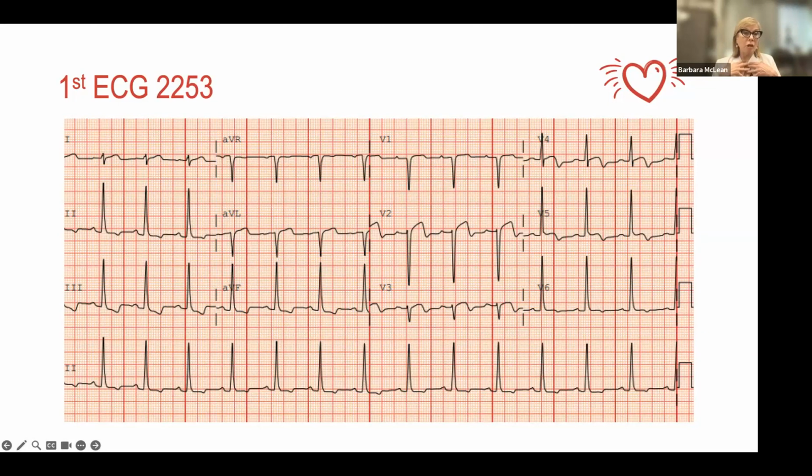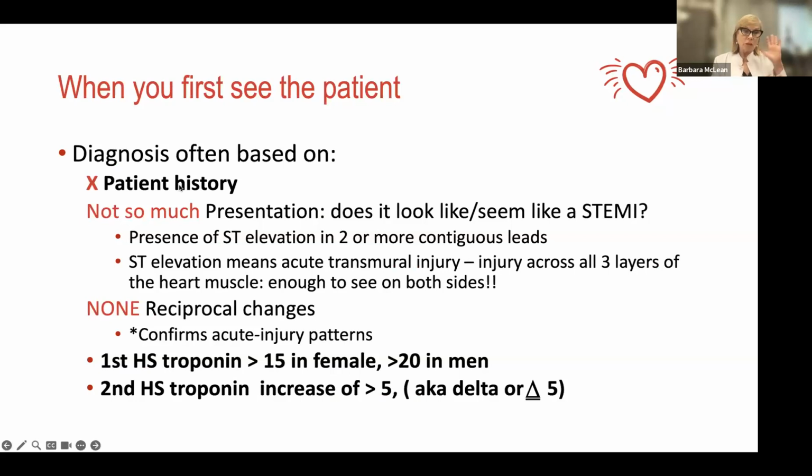So from my point of view, I'm going to be honest with you. When I looked at this EKG, I said, I really don't see any clear signs of patients having a STEMI. Lo and behold, what I discovered from the chart, what I'm going to share with you, which we learned together, which is really awesome. Okay, so just going by what we know right now, except for the patient history, not really. And not so much in terms of the presentation. Really doesn't look like a STEMI. Don't have ST elevation, ST depression in opposite walls. I have some EKG changes that are kind of bizarre. I've got LVH, that kind of muddies up the picture.